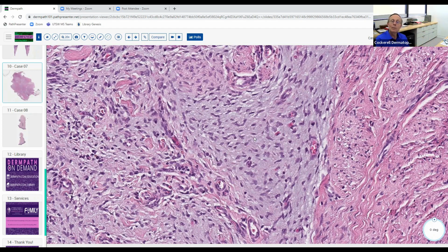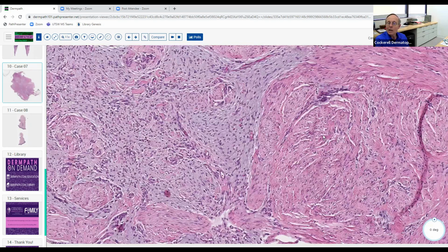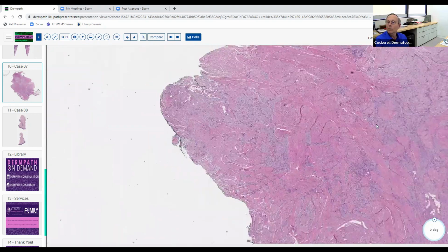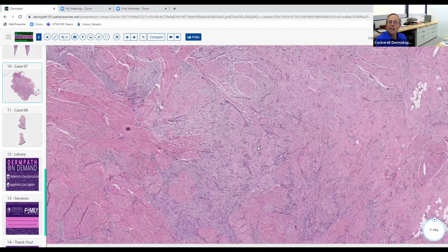So it's kind of an interesting thing. People are studying to see if we can learn how to produce this in adults, so you could do surgery without scar tissue eventually. A lot of research is going on about that. So this is what started the lesion. They have these whorls, and then they turn into these more prominent fibrotic areas here. And what if I told you this was in a 5-year-old or 3-year-old kid? It was a little nodular lesion maybe on the trunk. Any idea what the diagnosis might be?